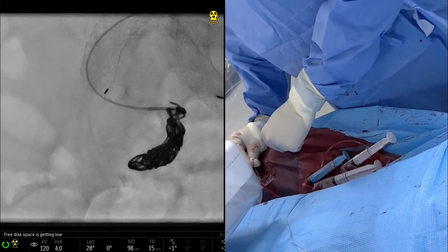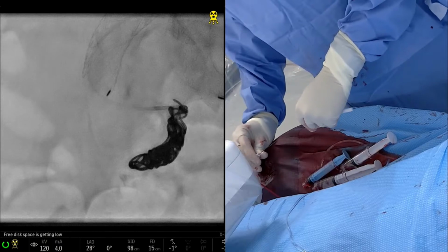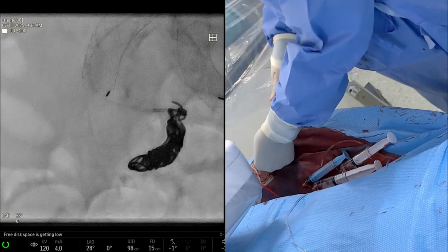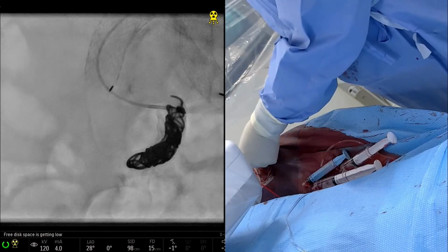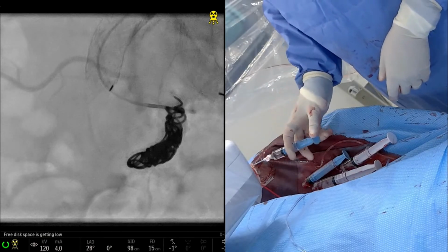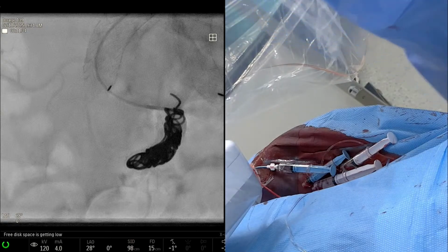You can see how the coils are bobbing, so you see the inflow. So it's not going to be fluid until the graft is in. I haven't used this coil, so I'm kind of excited to see. Oh yeah, see there's that branch that's going up, that superior sacral branch. But I think if we just put another packing coil, it should cover it. Can we get another 30?